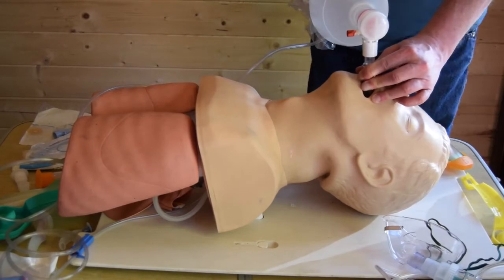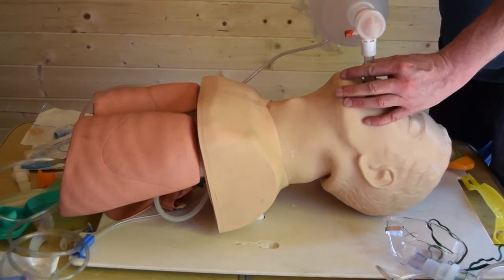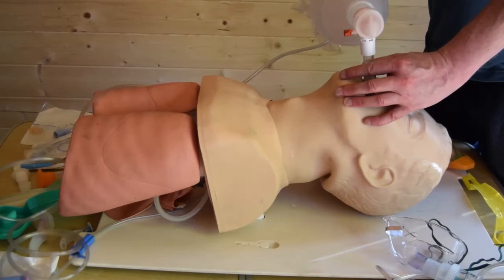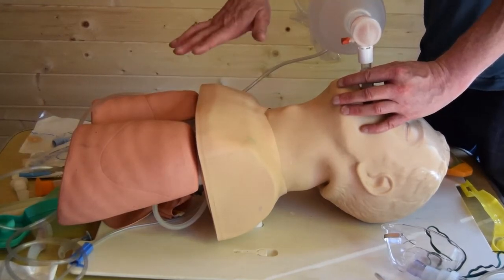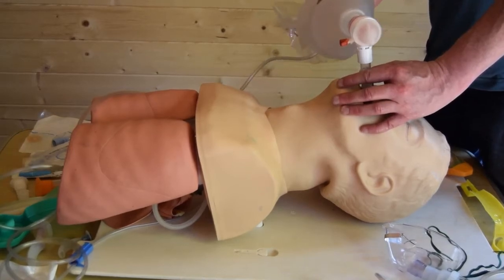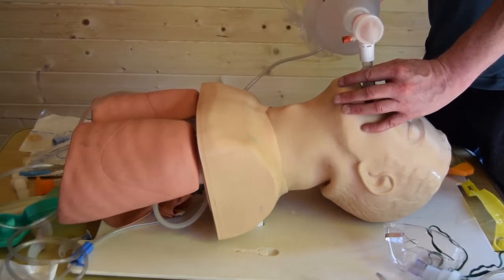While we have the patient with the BVM in situ, if we had to support somebody's respirations, we'll be aiming to ventilate them at a rate of 10 to 12 per minute, approximately 1 every 5 to 6 seconds. You don't need to overinflate them, and that'll give them sufficient oxygen for bodily purposes. What we're aiming to do is just raise the chest so we can see the lungs are inflated. You don't need to give it a big squeeze because that'll be far too much. You just need to give it a little squeeze, just enough to raise the lungs.